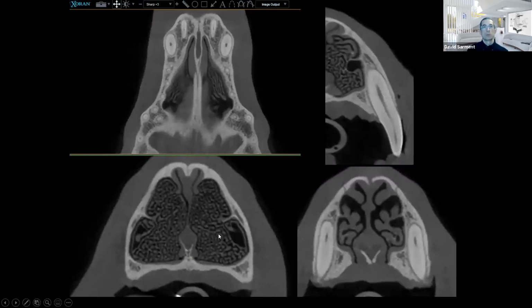So I always like to show normal anatomy because this is where we should start. So here's normal anatomy in the various cuts again. This is an axial view, another axial view here. Here's a buccolingual cut. This upper right quadrant now is not one of those three planes. This is yet another cut, another approach, which we can create at any time, at any point. We can artificially make another cut of the anatomy if we want to and focus on one area. And we can do this in all directions, including buccal palatally through a root if we wanted to.